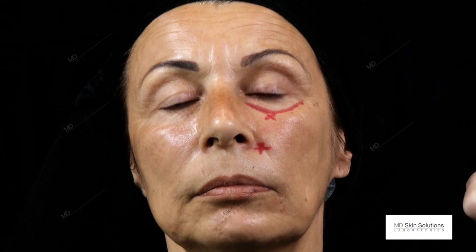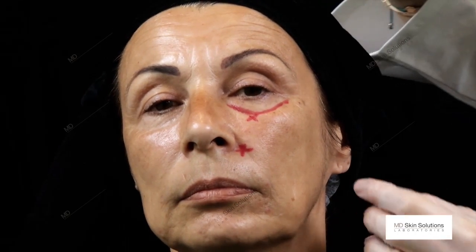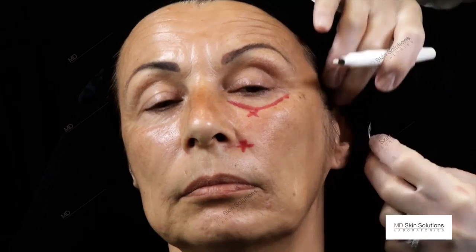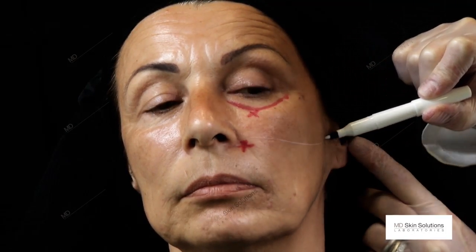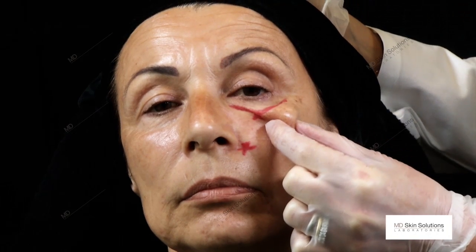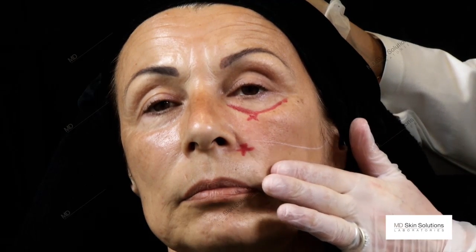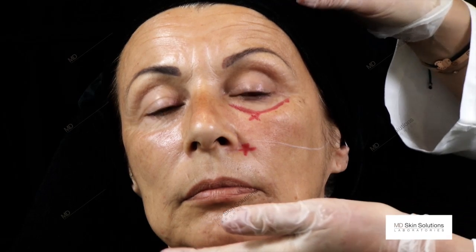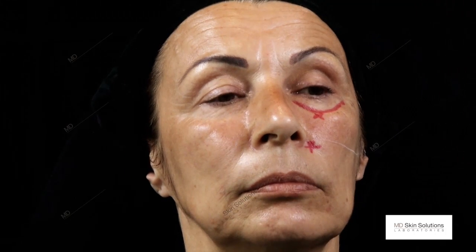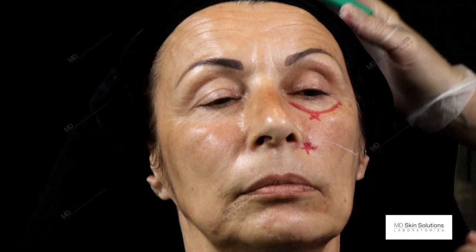Then there is a strategic line we are drawing to understand where the filler has to be placed, in what kind of manner, how. This is the alar tragus line. This line tells me to stay deep once I replace volume in the upper part of the cheek, and to stay subdermal in the lower part. Then there are the lines which show me how to find the entry points for each injection.